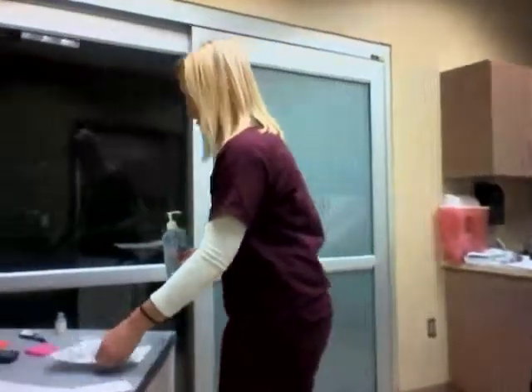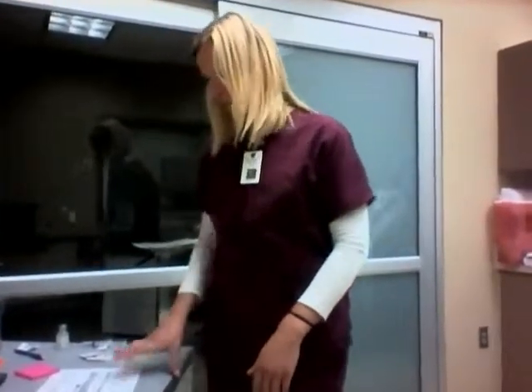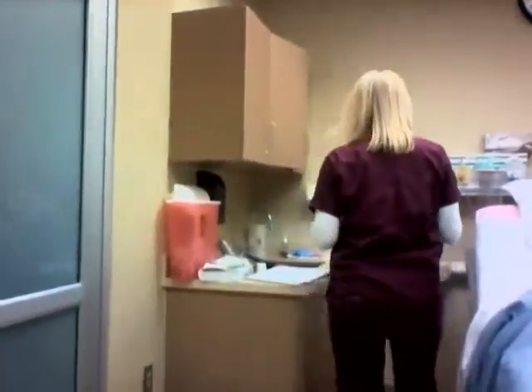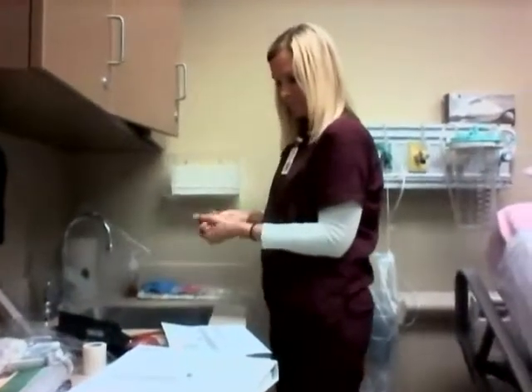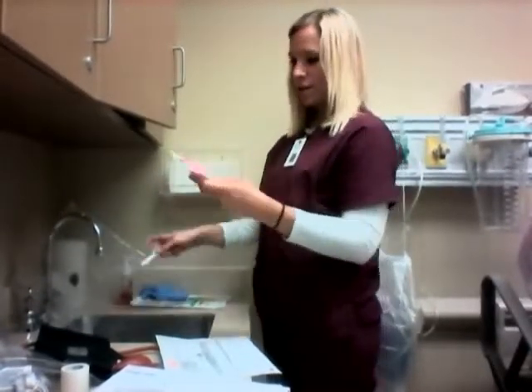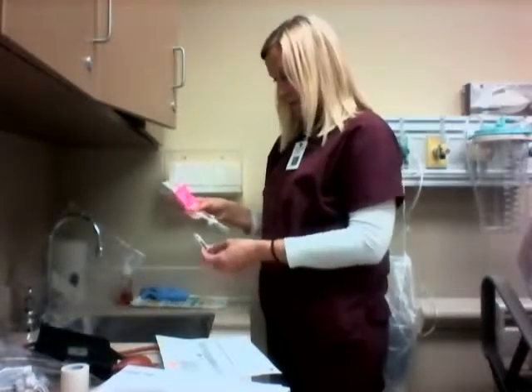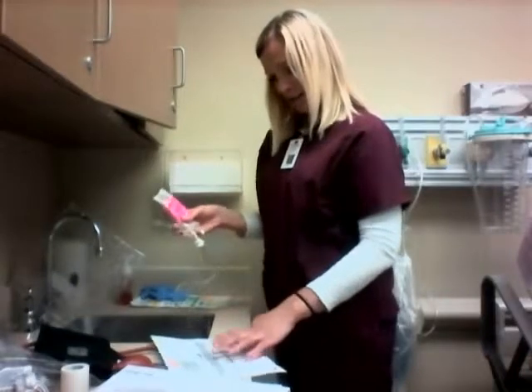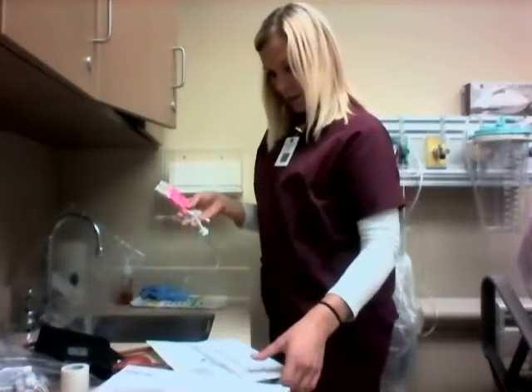Okay, so now I'm back in the nurse's station, and it is time for me to prepare the IV infusion of the Cardizem, so I'm going to go back to my medication room and get that. Okay, so before I do that, I'm going to wash my hands here. And I have found the Cardizem for the IV infusion, and I'm going to check that it's the right dose. I have 125 milligrams per 125 milliliters, so that is correct. And then I'm going to check my rates, the right patient, right dose, right time, and right route. So I'm going to take this and I'm going to go back to the nurse's station.